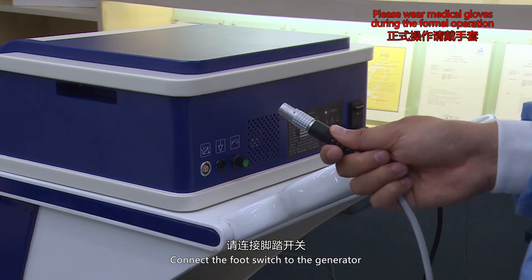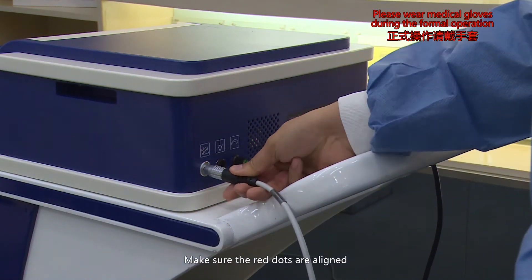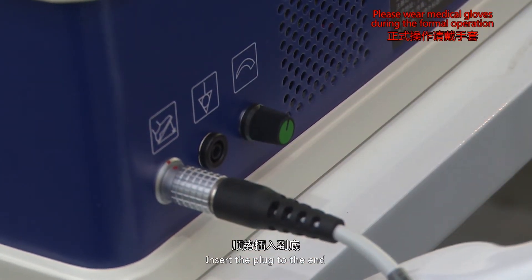Connect the foot switch to the generator. Make sure the red dots are aligned. Insert the plug to the end.